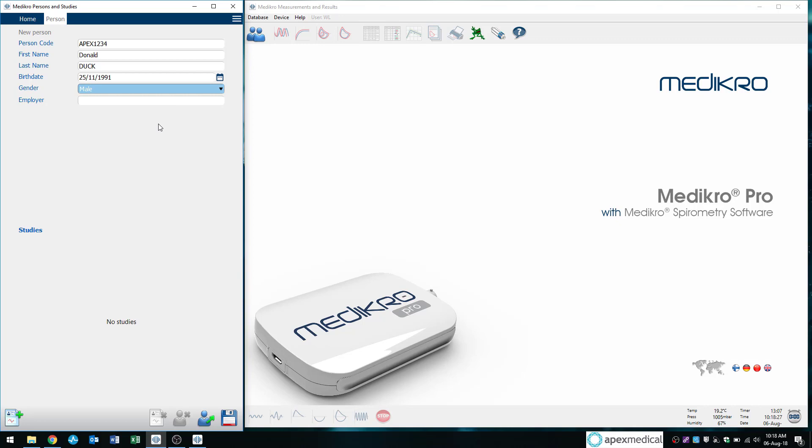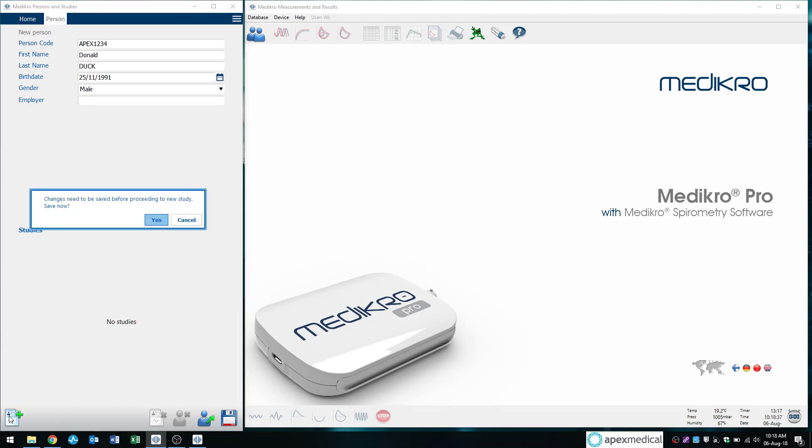And we can proceed to the next step. So once again, we have to click the button at the bottom left, which has a little plus next to it where it says new study. I'll click on that and a popup will come up saying changes need to be saved before proceeding to new study. And of course we want to save this because we've just inputted these details. We hit yes.